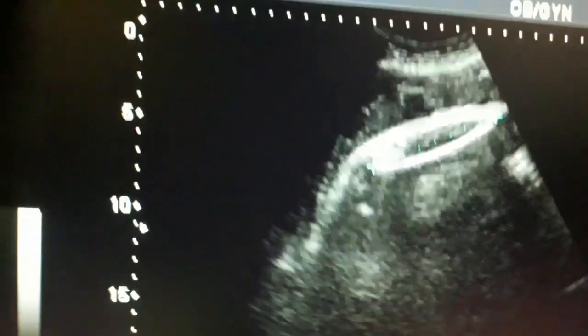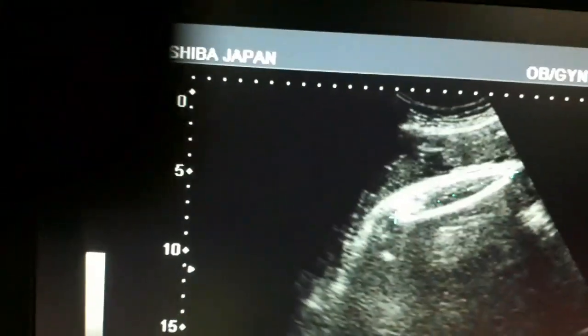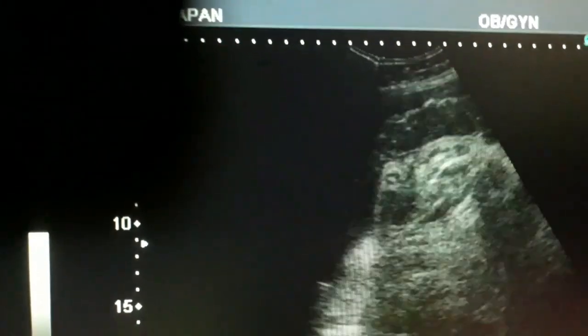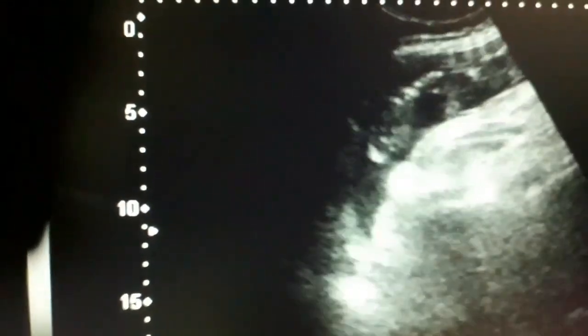Today we will discuss the detail of the sex as well as the placenta on ultrasound. Here you can see the femur bone of the fetus and there is a very good sex determination in this case. You can appreciate the testicle that is between the buttock and the placenta.